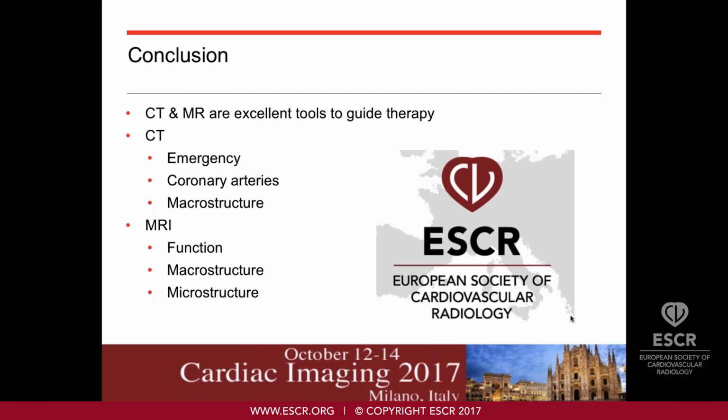Well, that's a very, very interesting question. We can use it. I see applications in two scenarios. First one is cancer, like the case I showed. Another application would be in the context of sarcoidosis, because here we often have the discussion, is this active sarcoidosis, is the activity decreasing or increasing? And at the end we end up quite frequently doing PET and MR. And if there would be a hybrid modality combining these two, this would be very helpful.